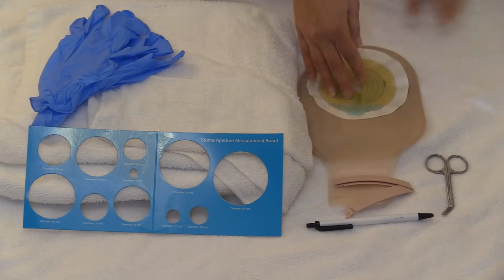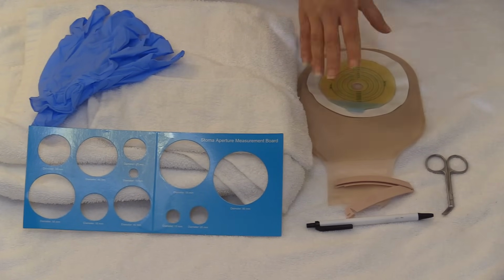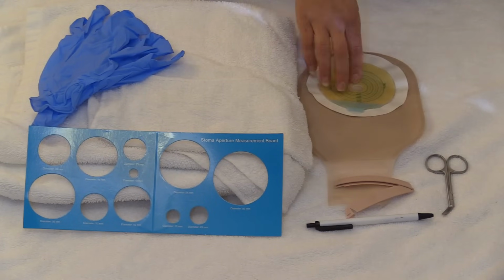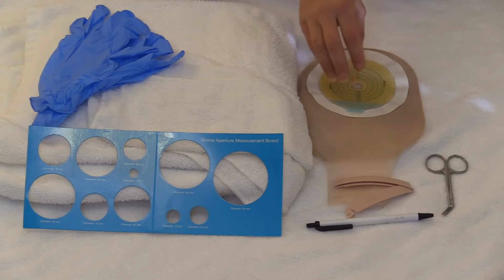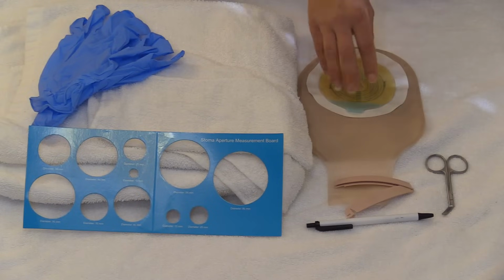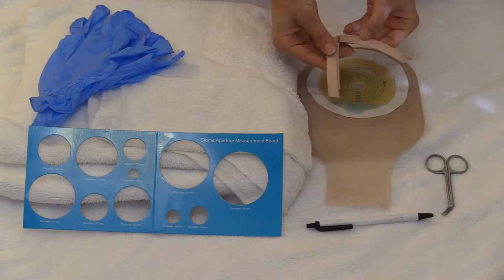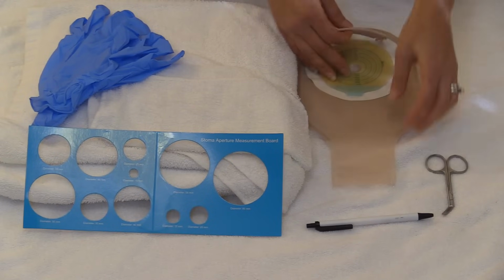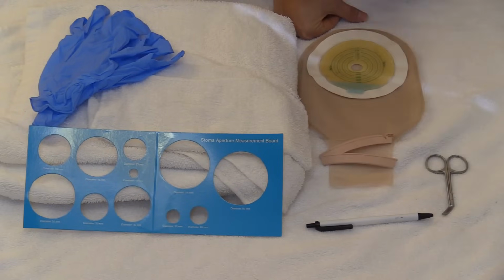Also, what you may need that I don't have right here is a barrier ring. The barrier ring will go around the stoma for extra protection in case the patient is having a lot of skin breakdown from stool getting onto the skin and the skin barrier just isn't really protecting it. So the barrier ring would go around the stoma, and then you would set the skin barrier on top of that. And with this particular system, we have a clip, so be sure you get the clip if your patient needs one. Some bags have Velcro, and that's how they close, but this particular one uses a clip.